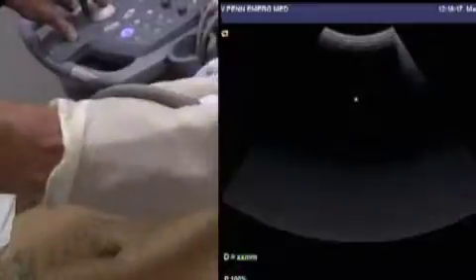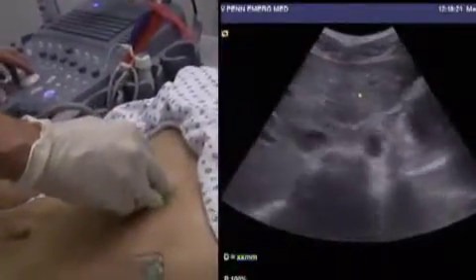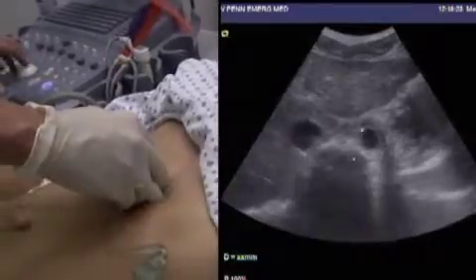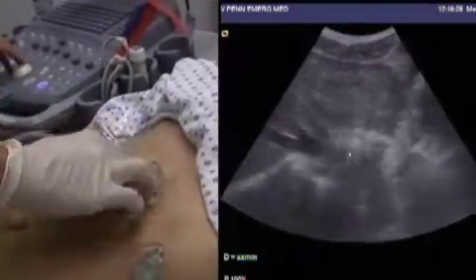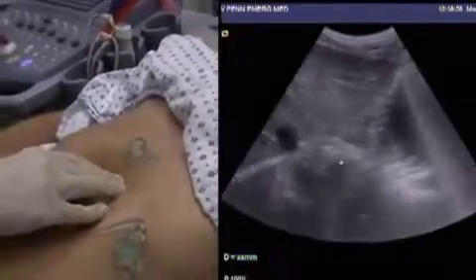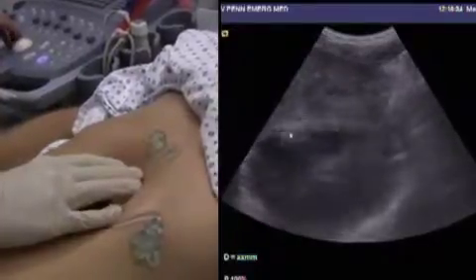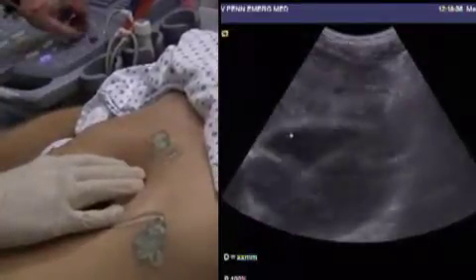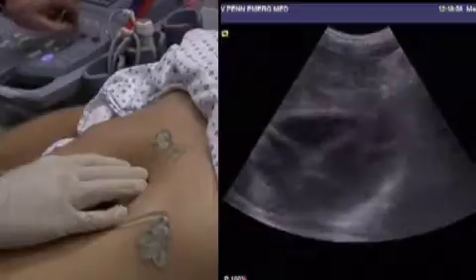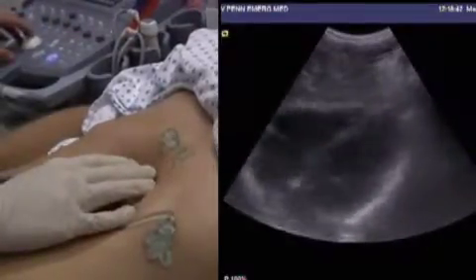Moving on now to the sub-xiphoid region, we have the liver right here and the vertebral body back here. We hold the probe in such a way as to push the abdominal muscles down and get a view behind the sternum, behind the sub-xiphoid, and the heart comes into view nicely here. We often have to adjust the depth so that we can see the posterior pericardium, and sometimes gain settings have to be adjusted here as well.